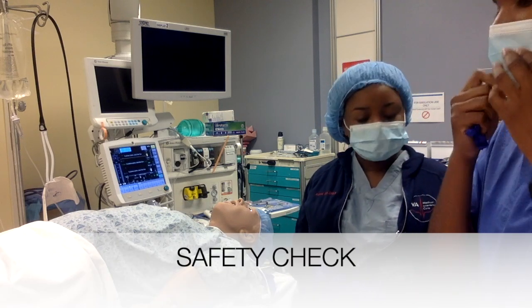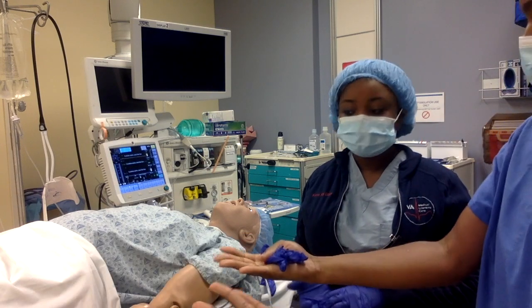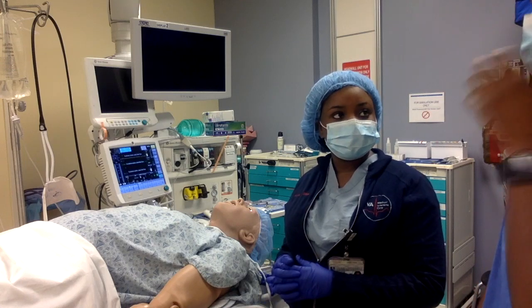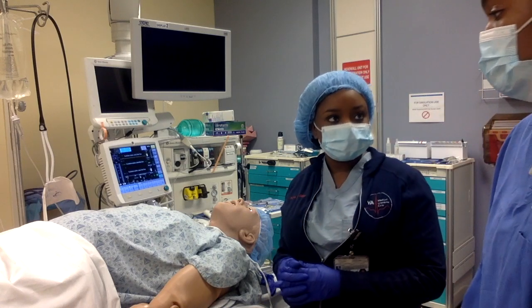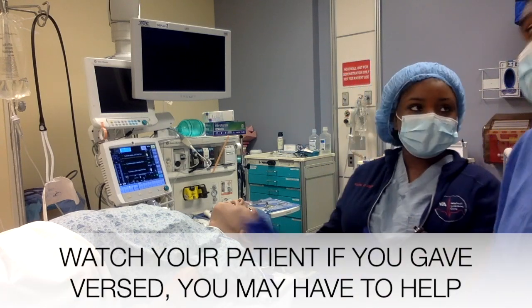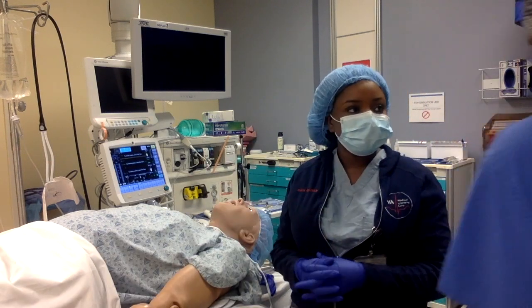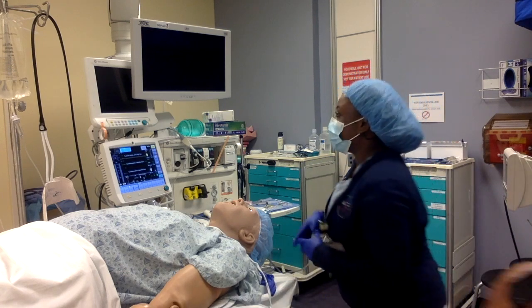Then you raise the bed up, line them up, and have them move over. Be careful with how much assistance you give - they might just need a little help. Once you've gotten them over to the bed, you start hooking up your monitors.